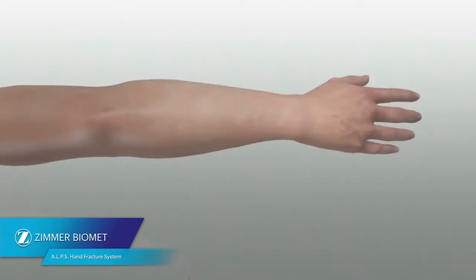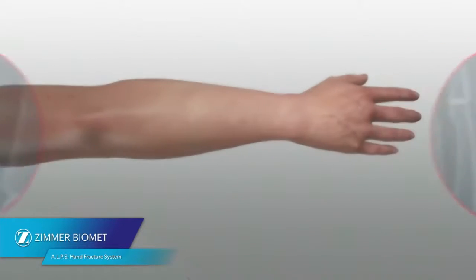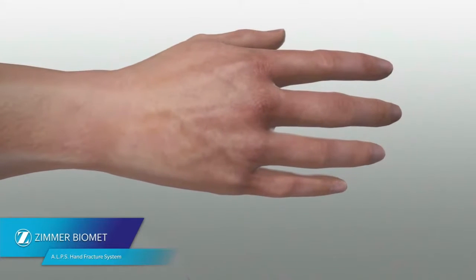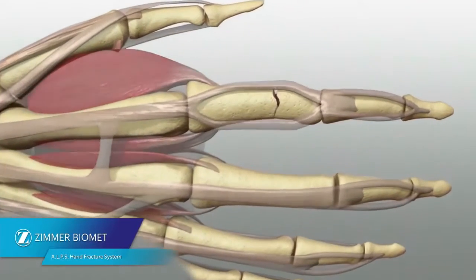To apply an ALPS Hand Fracture Plate to a metacarpal or phalanx fracture, begin by assessing the fracture fluoroscopically. Make an incision to expose the fracture site. Common approaches include a dorsal incision for metacarpals and either a dorsal or lateral incision for phalanges.